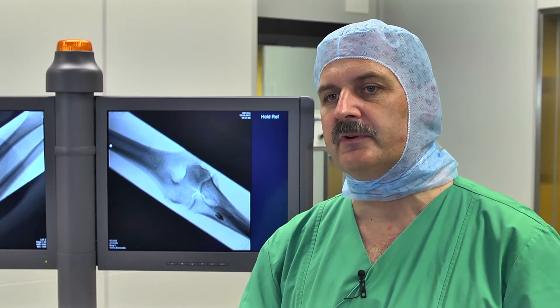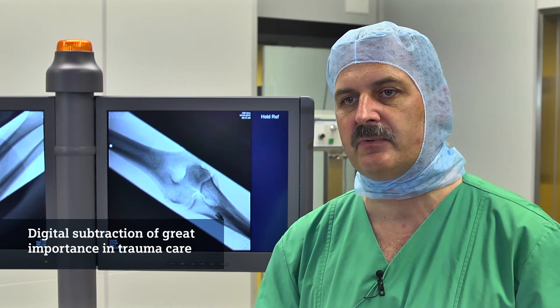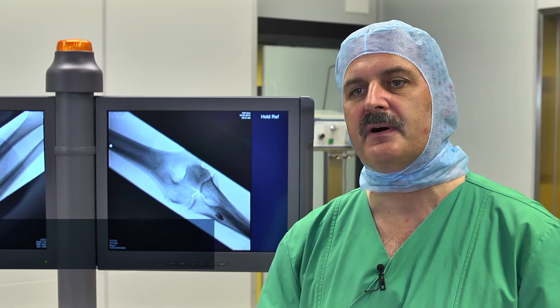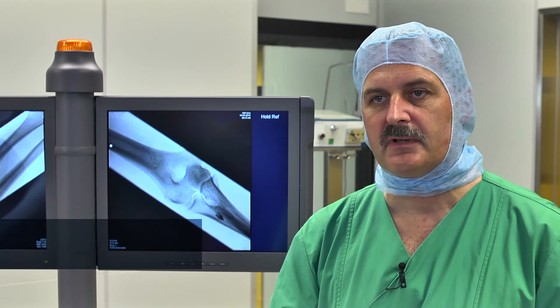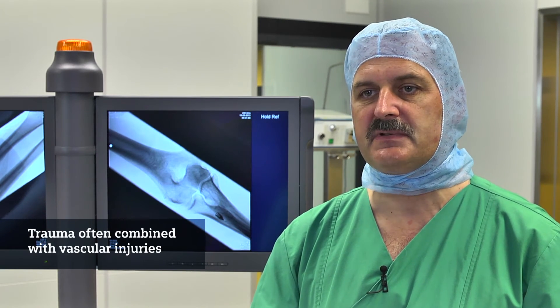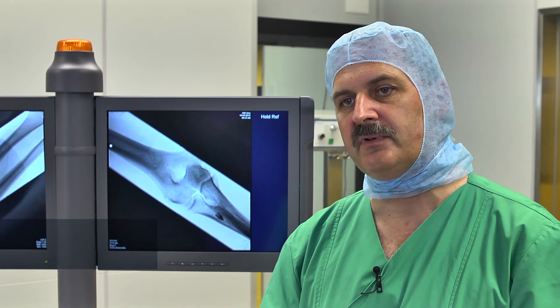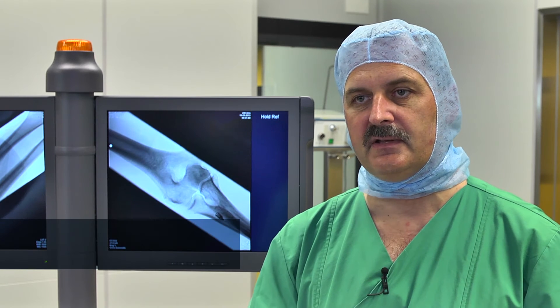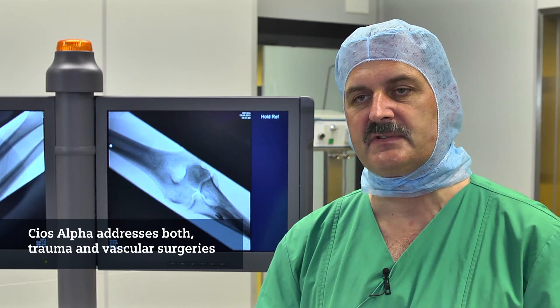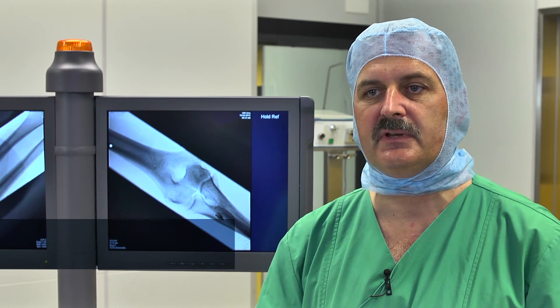It is of great importance that the system is available with a subtraction system so we can do a DSA, because we can share it with other departments. In trauma care we often have patients with vascular injuries. With one C-arm system we can address the vascular injury by performing intraoperative angiography to identify the leakage of the vascular system, the vascular surgeon fixes it, and then with the same system we continue for orthopedic surgery treating the fractures.